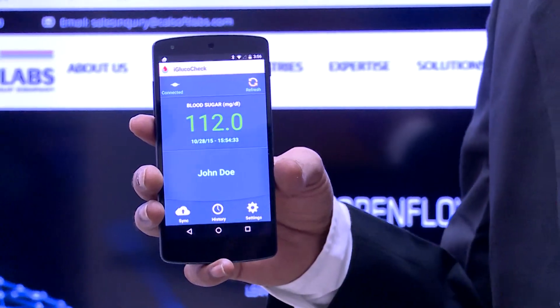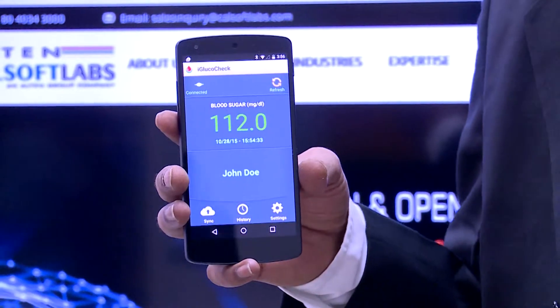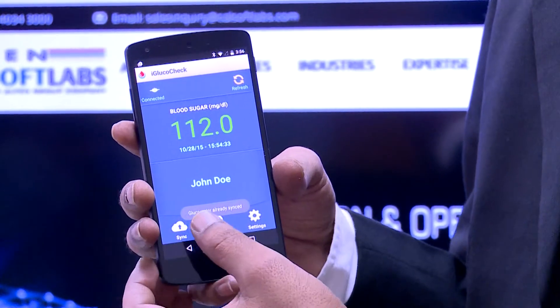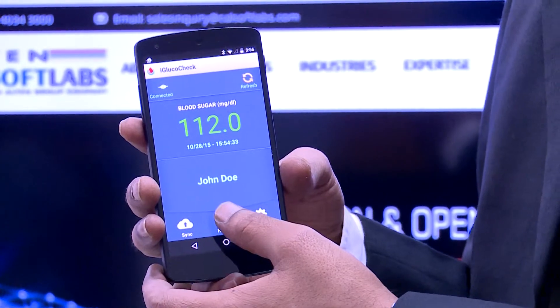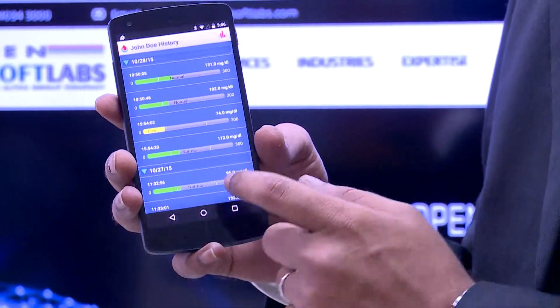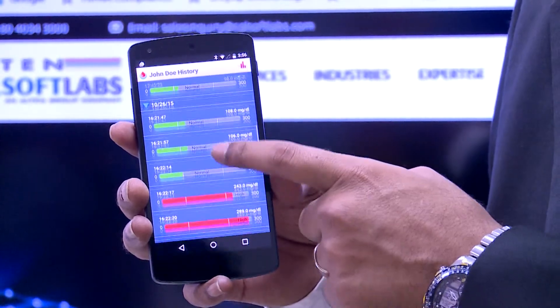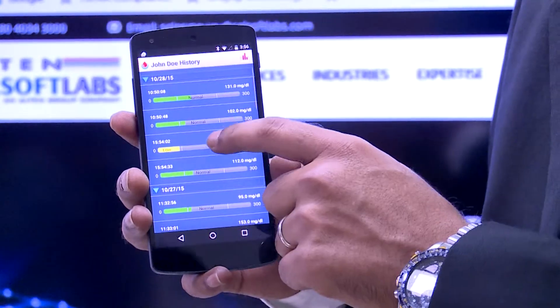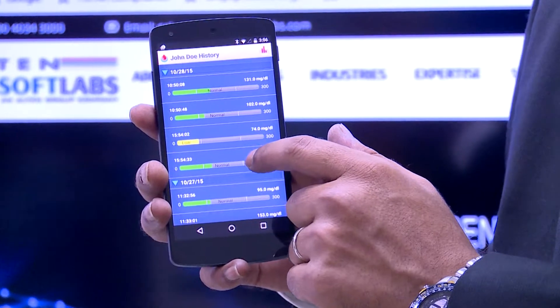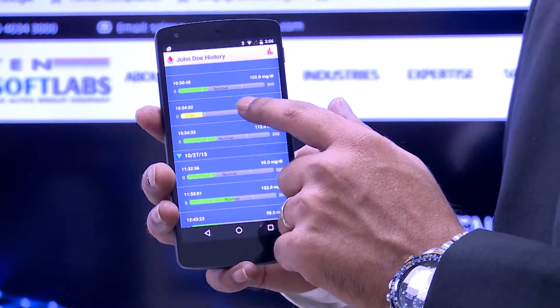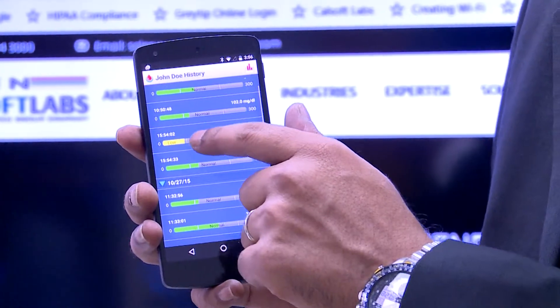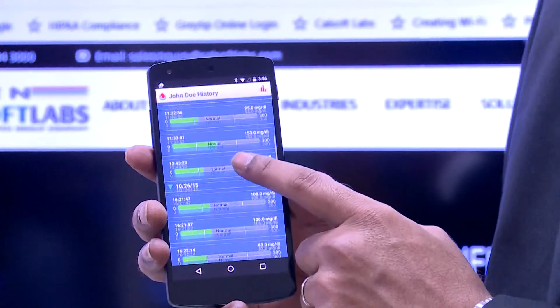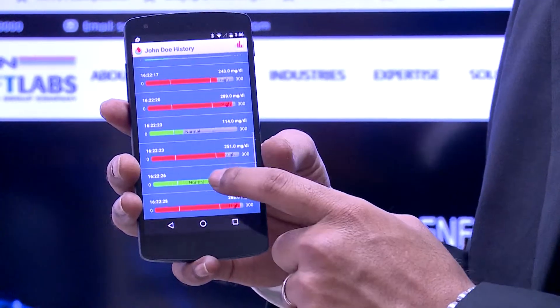The application also stores the historical data on the device, and it also syncs the data with the cloud as we have seen. For the patient to view the historical data, you can go to the history and check the past glucose data available here. The green ones are the glucose readings which are in a defined range termed as normal. The yellow one is in a range when the glucose level was read as low, and the red one is when the glucose level is high.